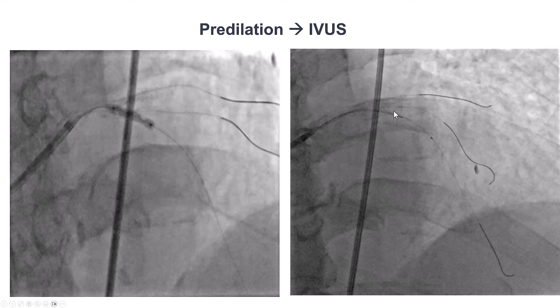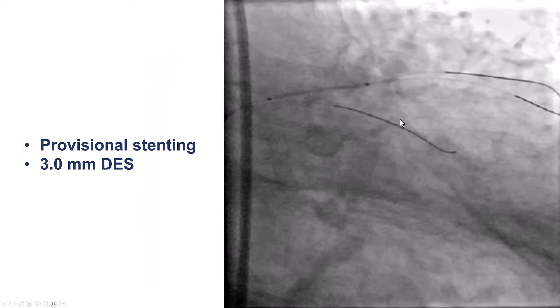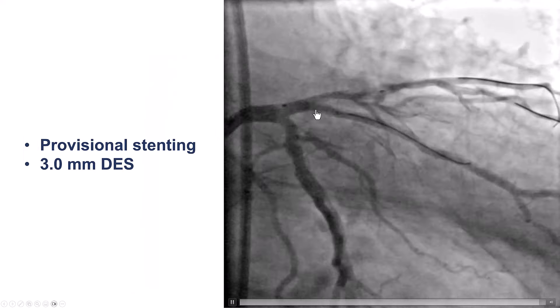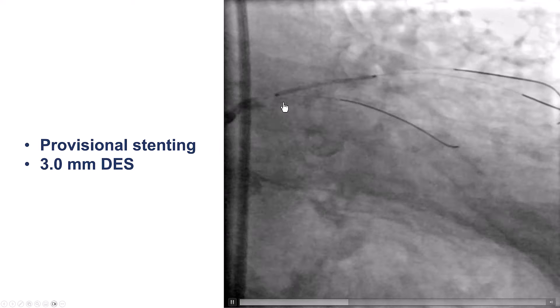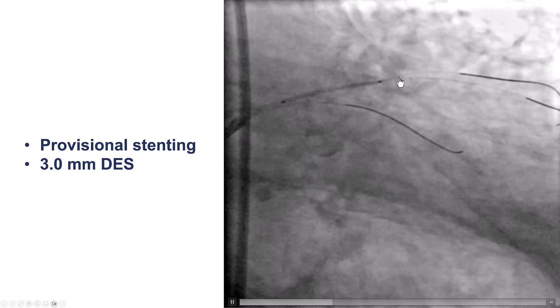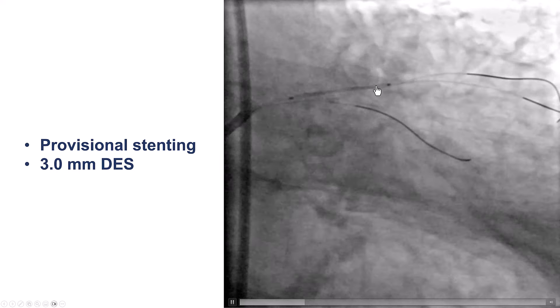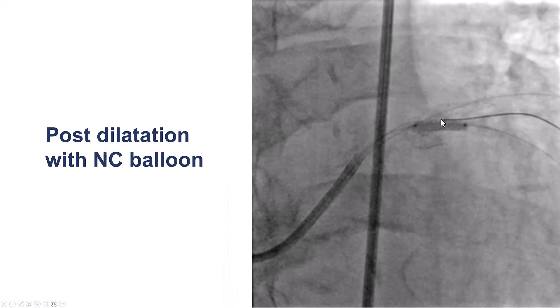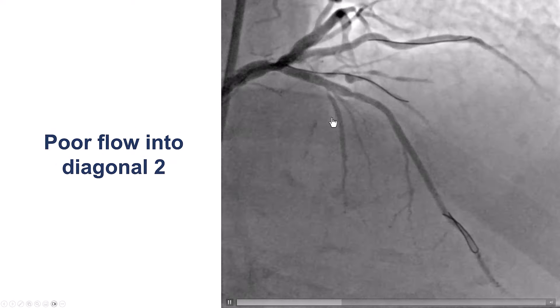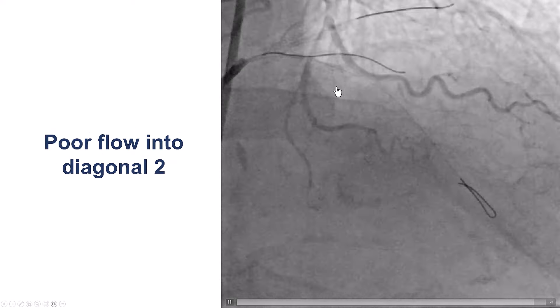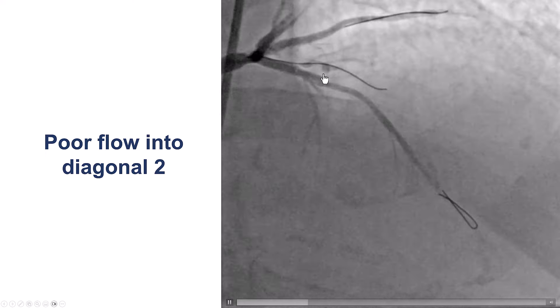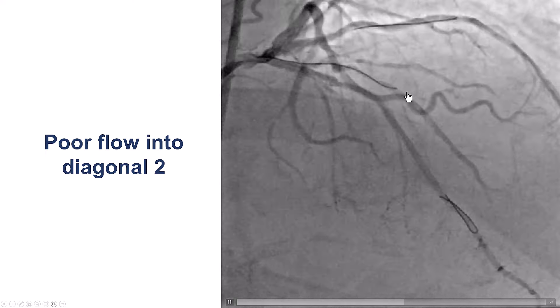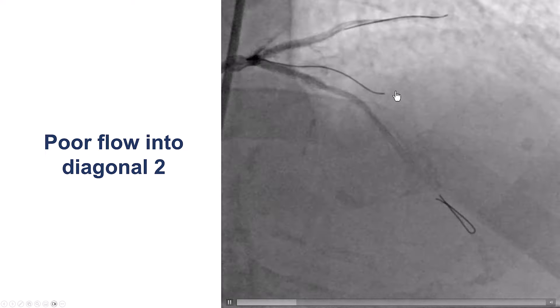After doing this, we pre-dilated, performed intravascular ultrasound to size the vessel, and then placed a long 3.0 mm drug-eluting stent proximal to the first diagonal and distal to the takeoff of the second diagonal branch. The stent was post-dilated with a non-compliant balloon, and we had two problems: one is the distal edge of the stent that doesn't look good, and the second is poor flow into the second diagonal branch.